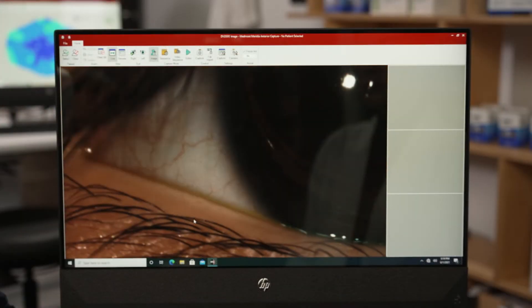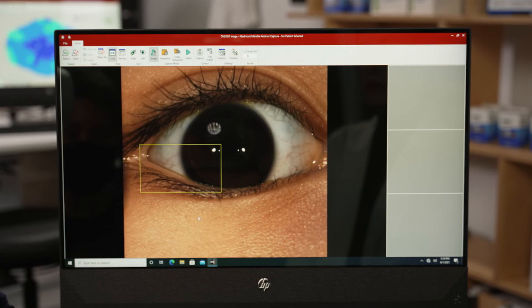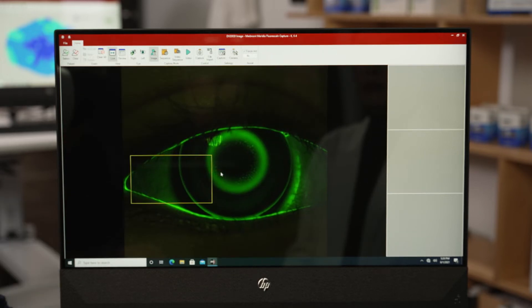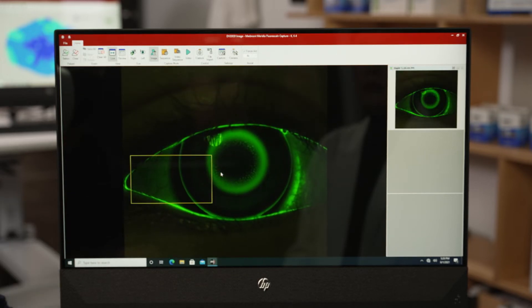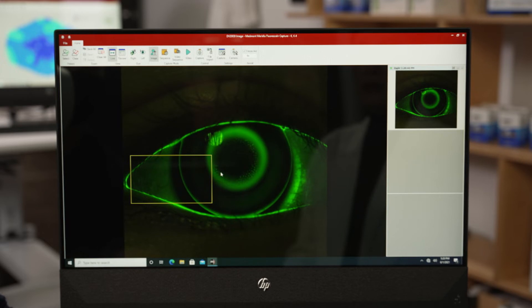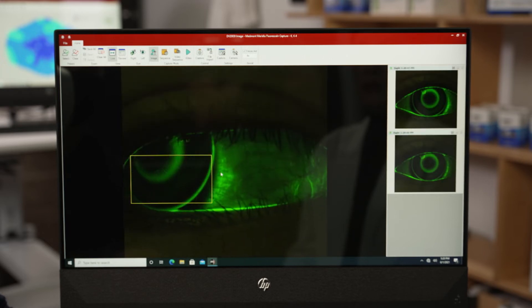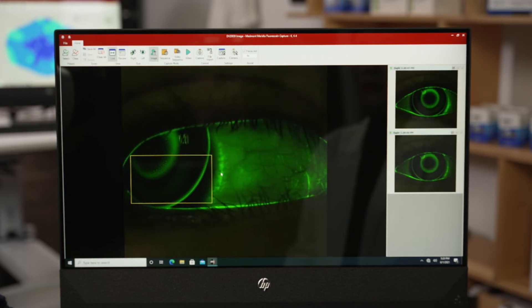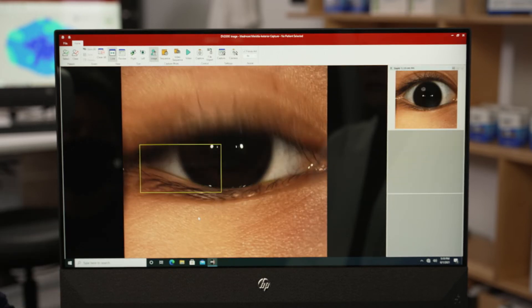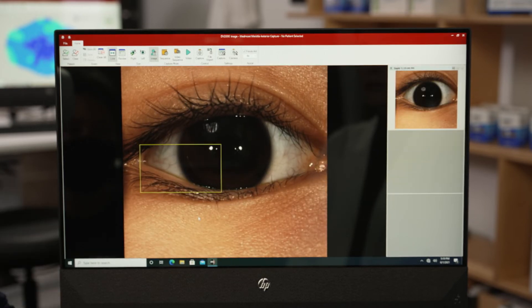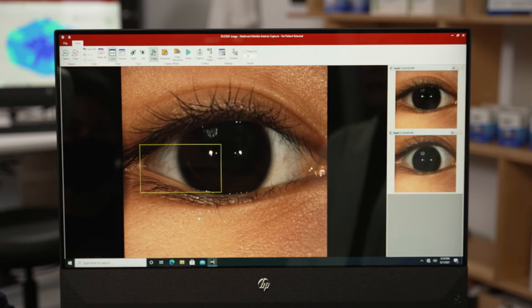With all the imaging options in your Medmont Meridia, you can take single captures or videos in any of the modes — be it fluorescein, meibography, or white light. With this powerful instrument, you have all your images, videos, and captures available in one software, making it simple and efficient to review and assess.